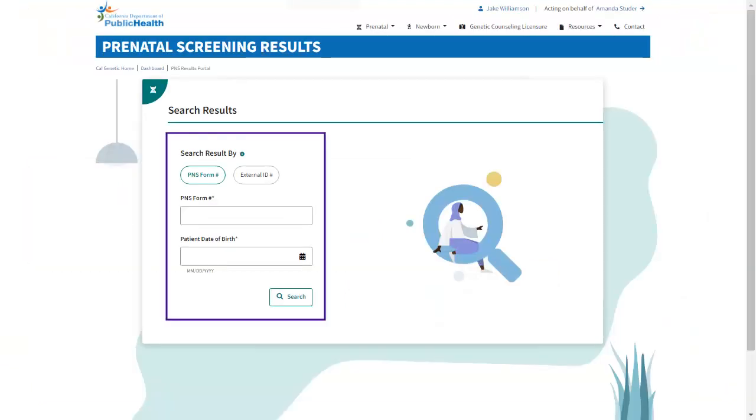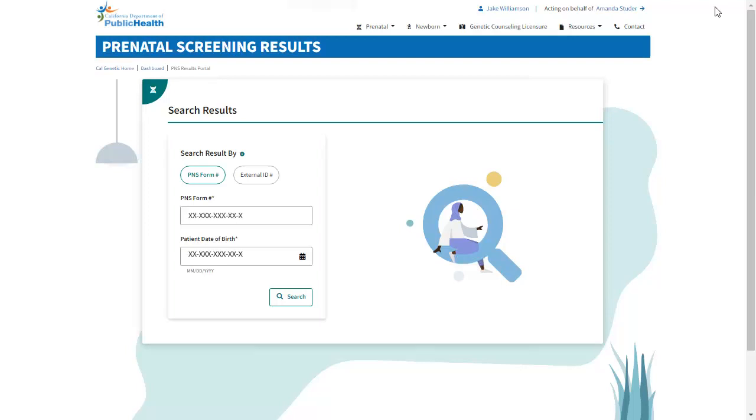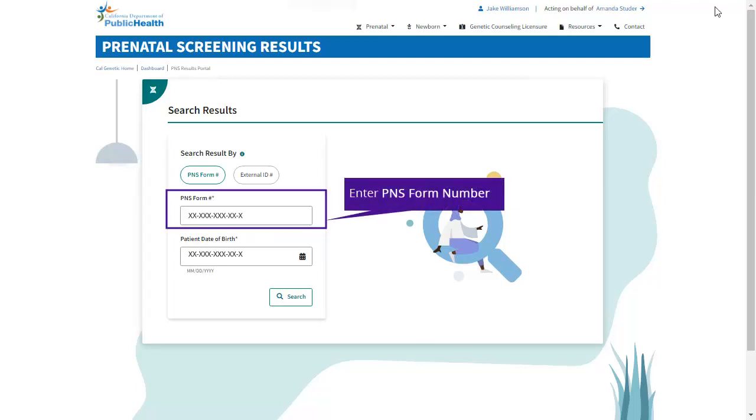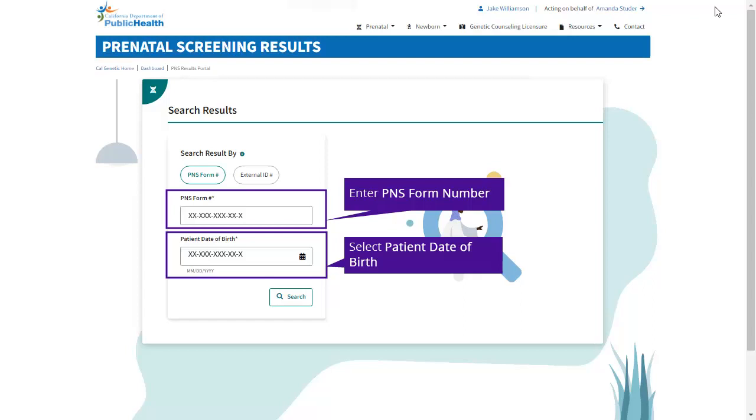On the Prenatal Screening Results screen, you can search for Prenatal Screening Results on the Prenatal Search Results card with either the PNS form number or external ID number. Enter the PNS form number and select Patient Date of Birth to search for the Prenatal Screening Result on the Prenatal Search Card.